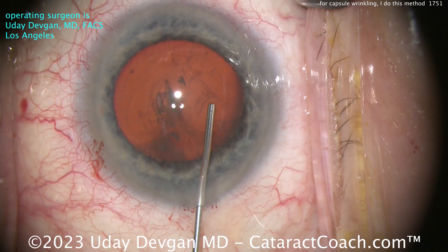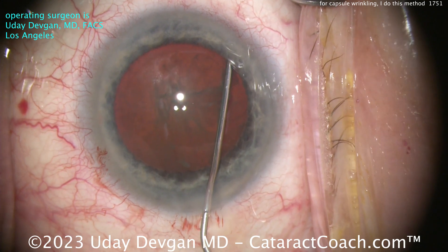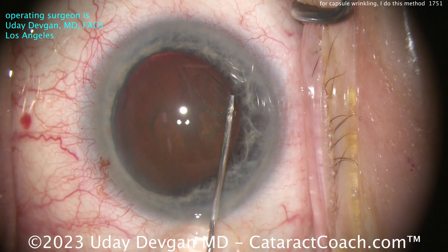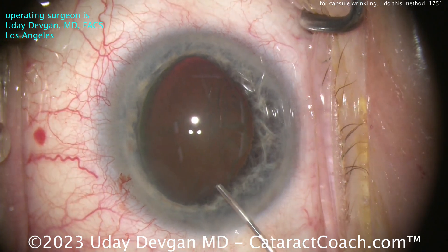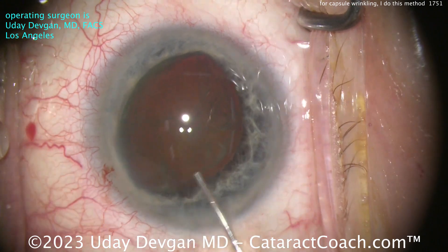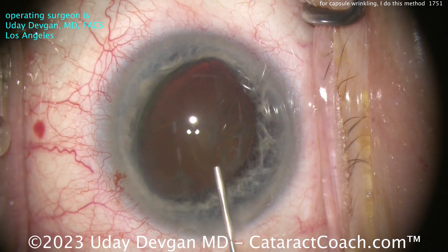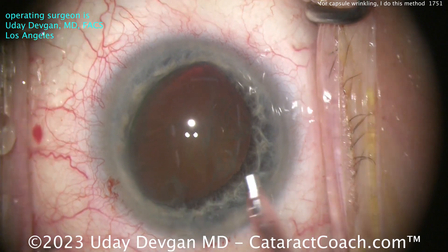What I do want is the nucleus out of the bag — I don't want to operate in this loosey-goosey bag. BSS going in to hydrodissect, nice and easy, slow and steady, not forceful, taking my time. There it is — nucleus comes up. Let's rotate this a little bit, make sure that nucleus is sufficiently up halfway into the pupil. More viscoelastic to protect that central endothelium.